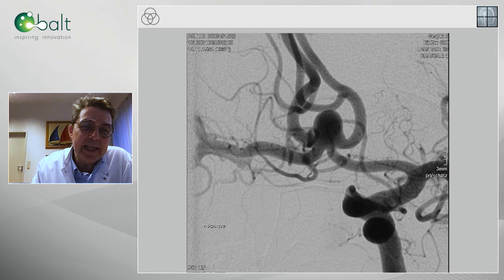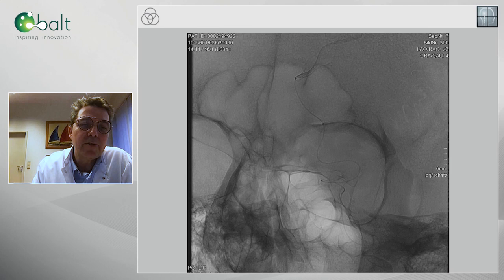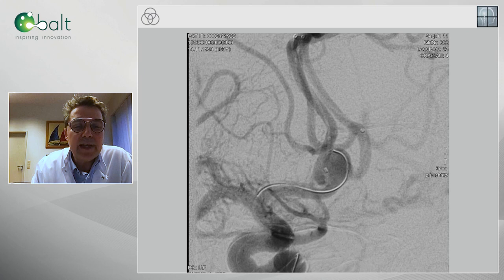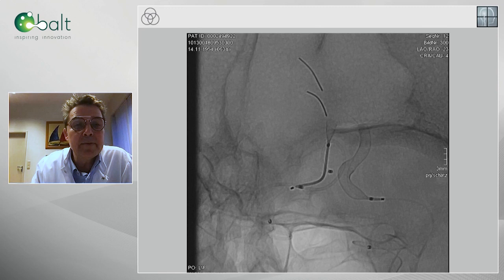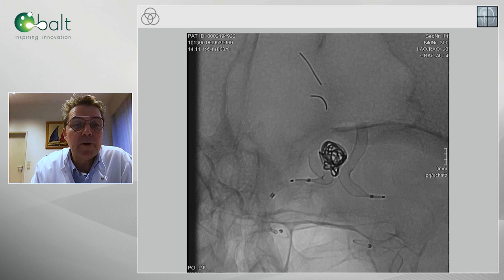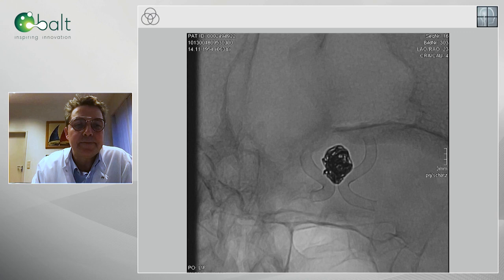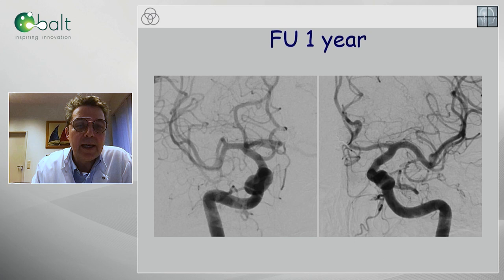Here we chose to remain ipsilateral because it's a disease of the ACOM, which is now absolutely abnormal. So if you want to isolate all this, stay ipsilateral going from A1 to A2. That's the challenging part — you need to do a loop with the microcatheter through the aneurysm. We went ipsilateral A1 to A2 on both sides, leaving the microcatheter inside. After bilateral placement of both flow diverters, some coils were added. After treatment on the left side, there is no flow left going from left to right. After one year, you see a complete disconnection between left and right side.